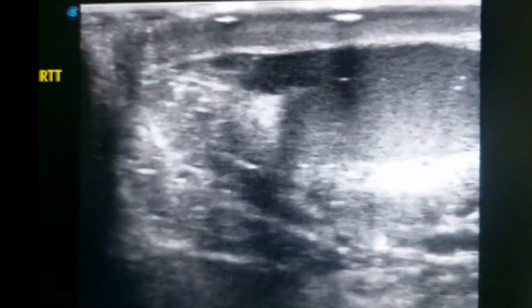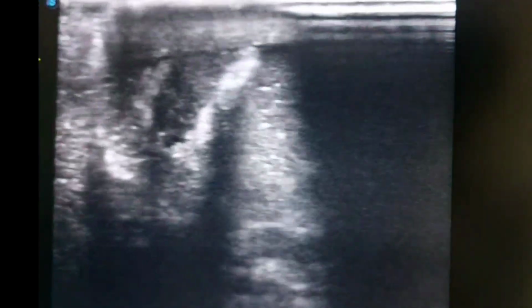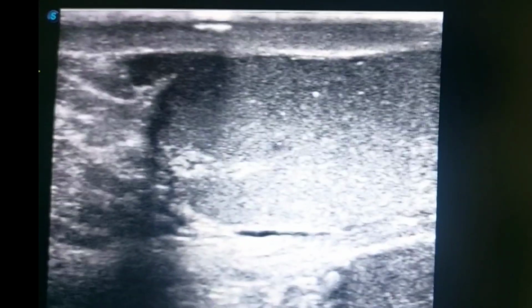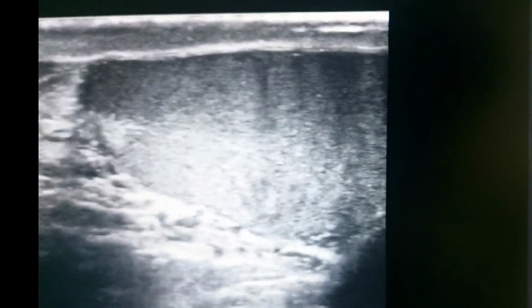On this testicular ultrasound, you can see in view there is a right testis, and within the right testis there are multiple calcified foci. So these are actually a diffuse intratesticular microlithiasis example. In the view you can see there is the testicular mediastinum, and you can also visualize the epididymis on the top. If you look throughout the area, you will be able to see that these are more than 5 calcifications in field of view. So keeping the presentation and the number of calcifications in view, you will have to label it as diffuse testicular microlithiasis.